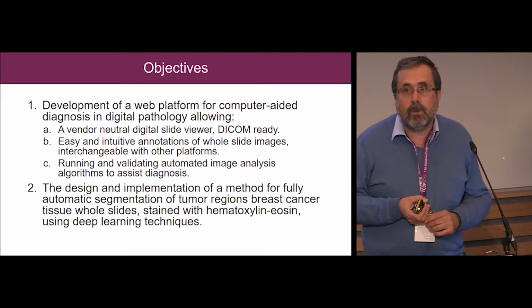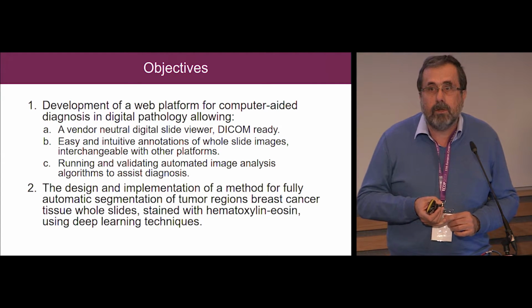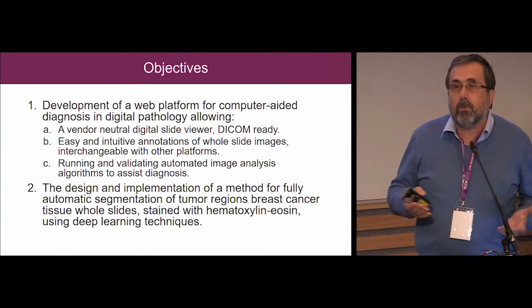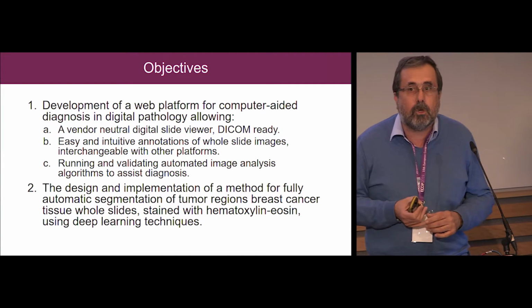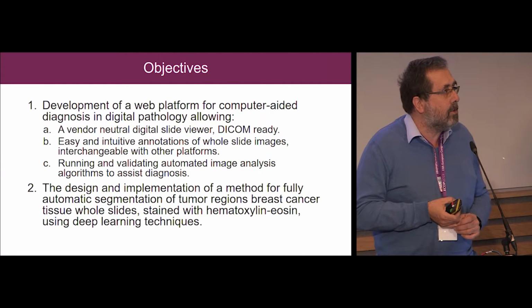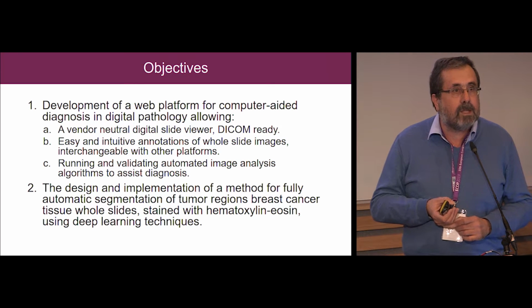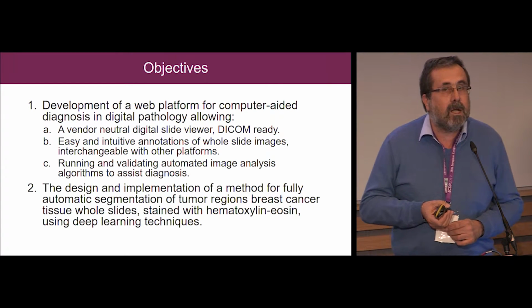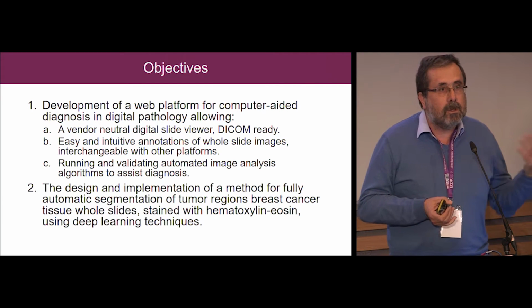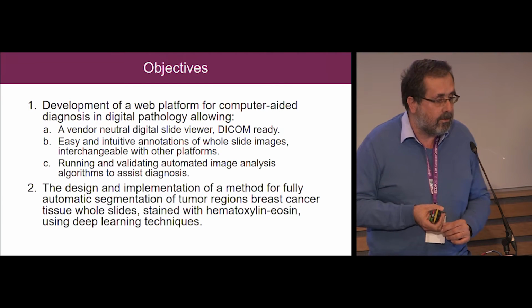So the first thing to do was trying to normalize the different formats, which is more or less easy because you can export. But then we decided that the format in which we were going to work was the DICOM format, and we planned to do all the image analysis and all the work on these DICOM files.